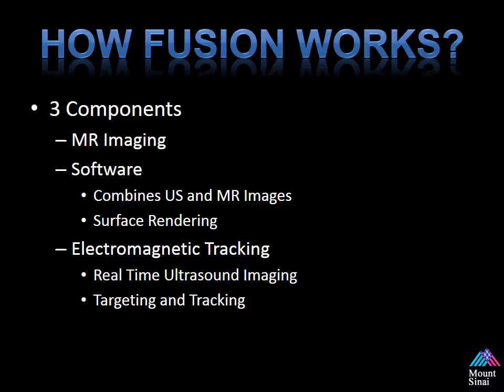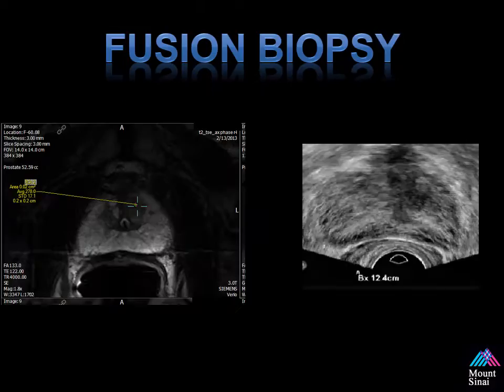In the platform I'll be discussing today, it uses electromagnetic tracking. Other technologies use different ways to solve this problem, but tracking itself allows for the real-time ultrasound imaging to be combined to allow you to target and track the prostate.